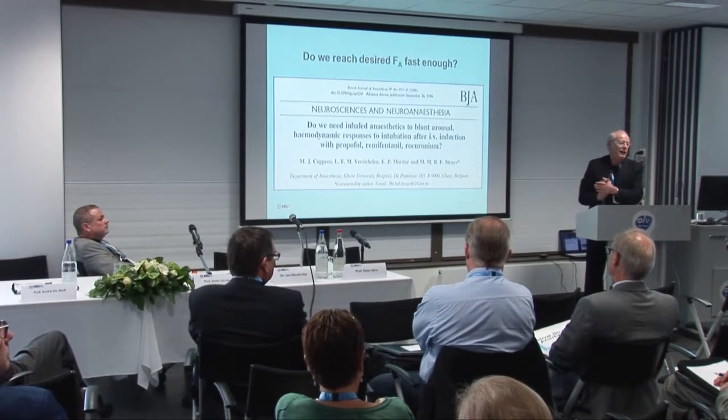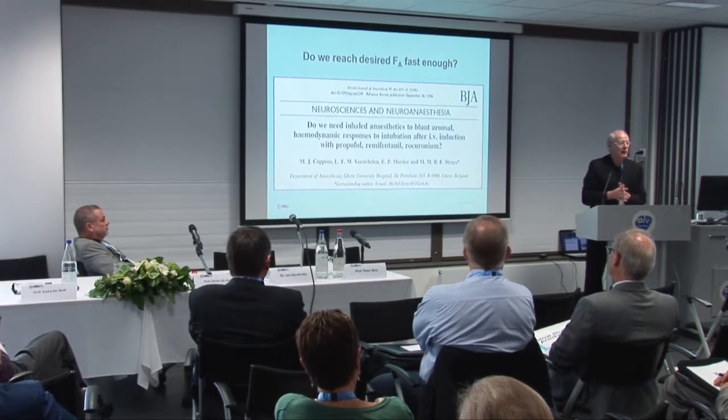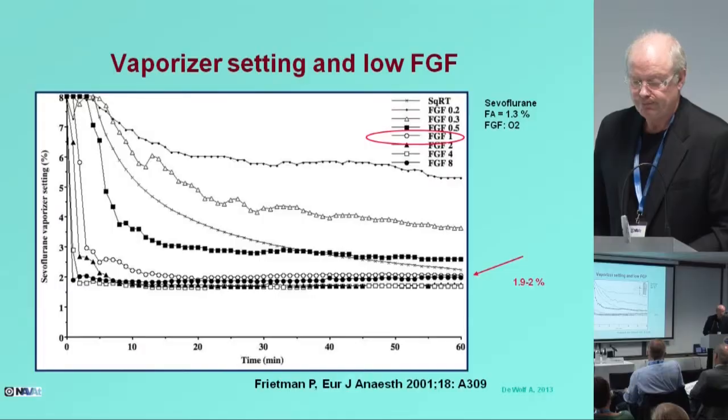You have plenty of time, 90 seconds, to do an intubation without any hemodynamic response. Based on that, after intubation, your patient is typically not stimulated for several minutes. So if you reach your desired concentration within 3 minutes, that is fast enough in my opinion. So the chance of awareness is basically 0.